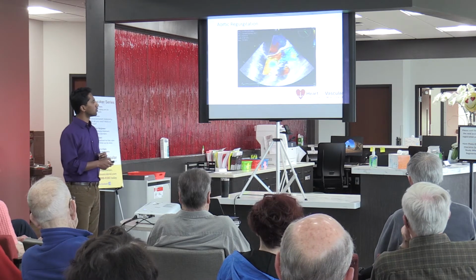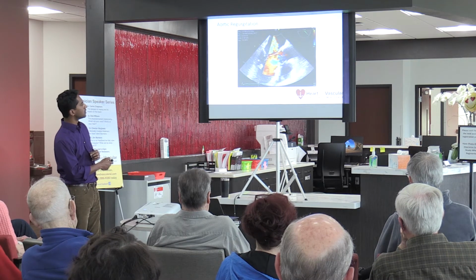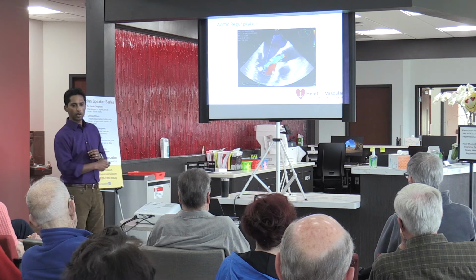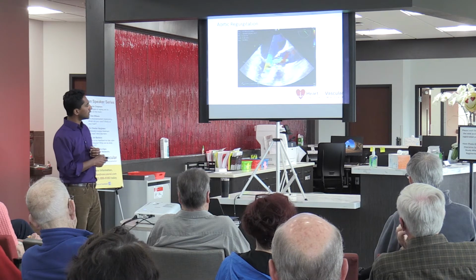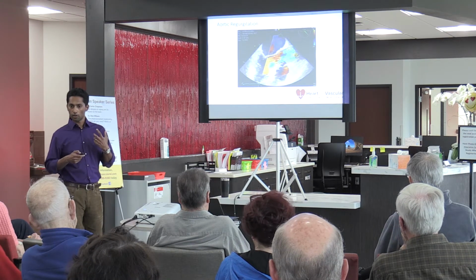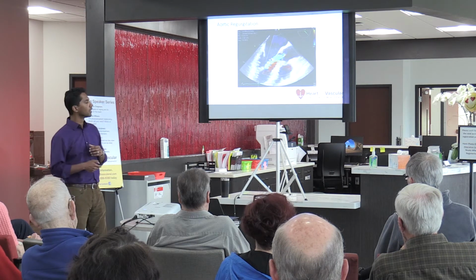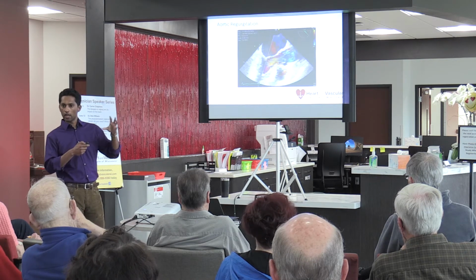So this is a very nice picture that I stole from one of my colleagues, very shamelessly. But this is the aortic valve. This is what's called an echocardiogram. An echocardiogram is a sound picture of the heart. This specifically is a special kind of echocardiogram. It's called a transesophageal echocardiogram. It's a probe that you swallow. And so it gives us these very, very close-up, very clear views of the heart valves and leakiness of the heart valves.